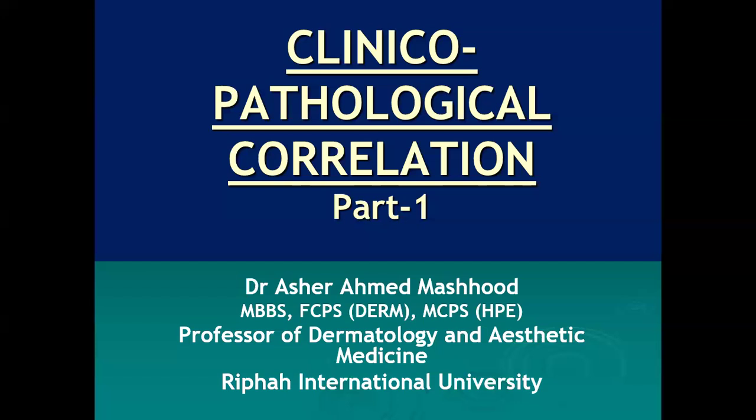In this series of lectures, I will be discussing a few clinical terms, and then I will be discussing the histopathological appearances that are associated with that clinical term. This series of lectures will help you understand dermatopathology more. So let's proceed to today's lecture.